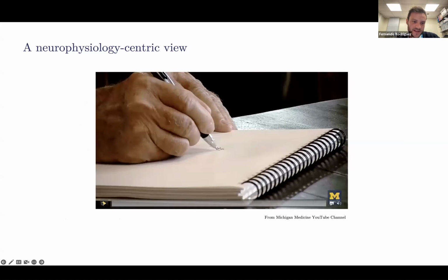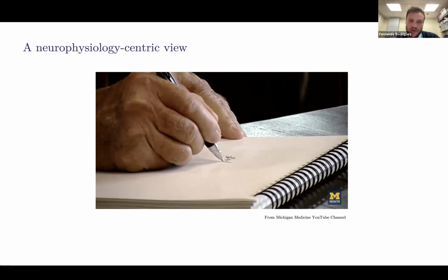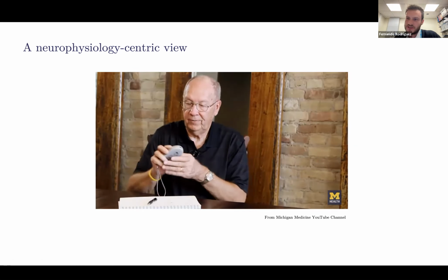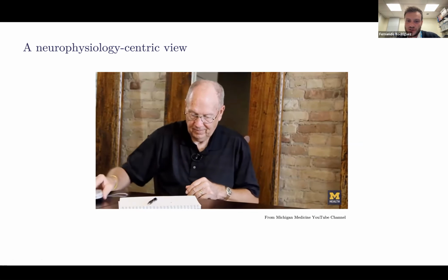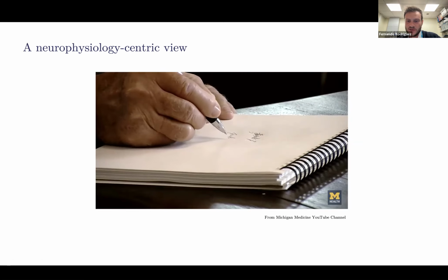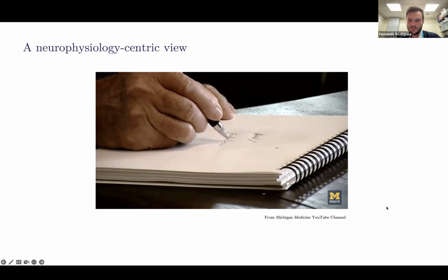So here I have a sort of mandatory video of an essential tremor patient who is very much struggling to sign because of his tremors. And then you'll see shortly that he takes a remote control, puts it to his chest, which is where he has an implantable pulse generator, or IPG, turns the stimulation on, and thereby the tremors quite quickly disappear, and he's able to sign his name. So this can work at times.